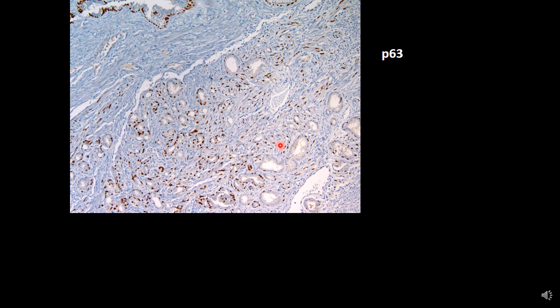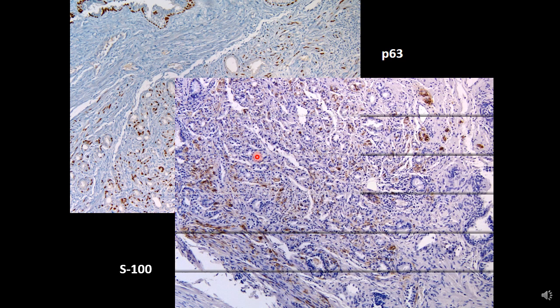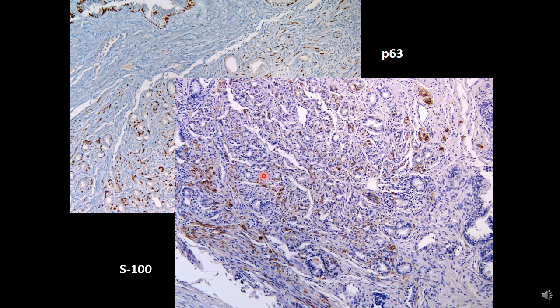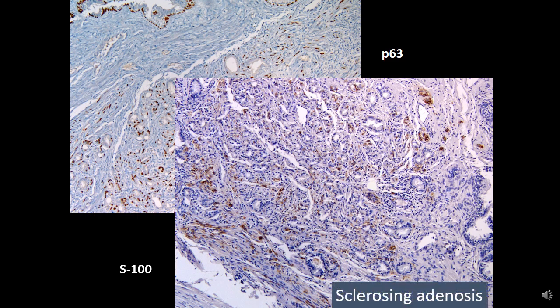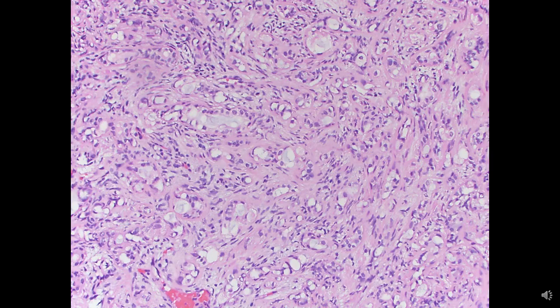When I did p63 basal cell marker, the majority of glands lit up. I also performed S100 stain which also demonstrated strong staining surrounding these glands. So the diagnosis of this case is sclerosing adenosis.